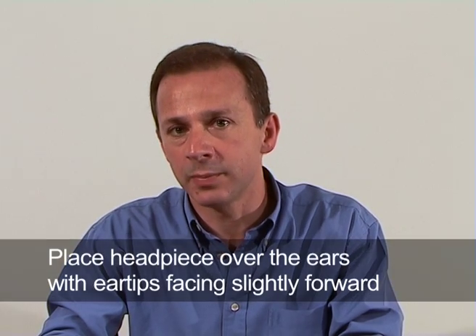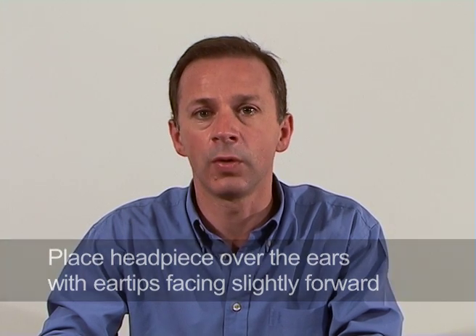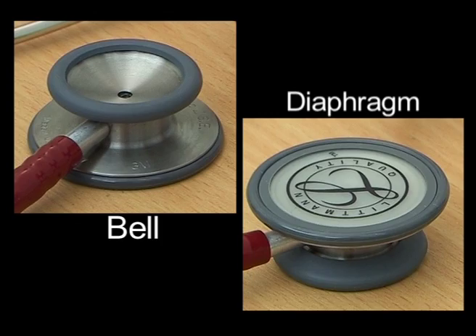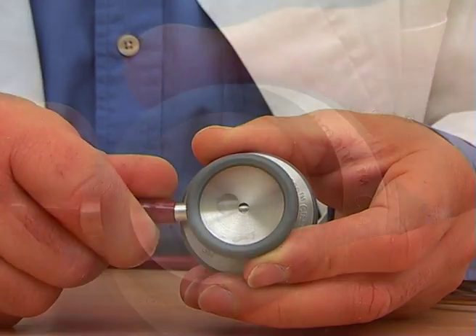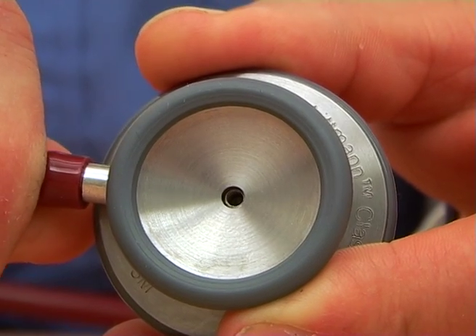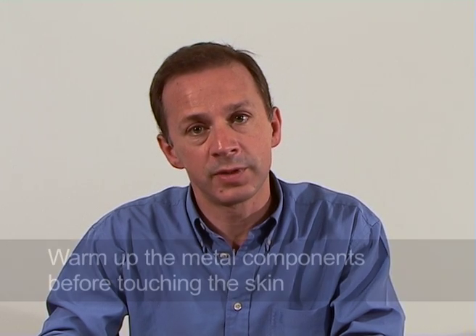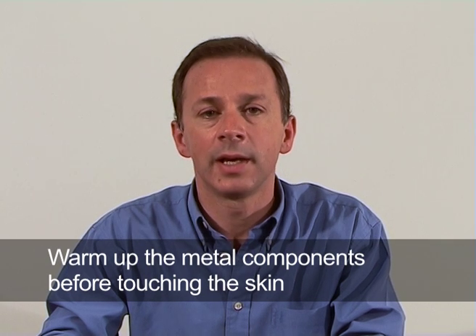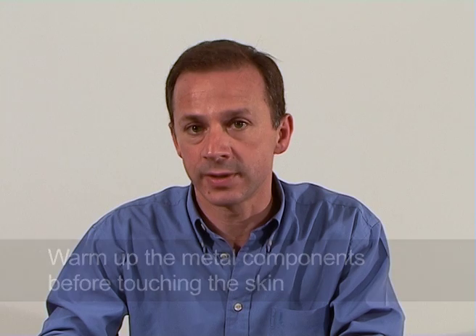Place the headpiece over the ears, ensuring that the ear tips are facing slightly forward. If the chest piece is double-sided, you need to ensure that you have turned the chest piece so that the open hole is connected to the side you will be applying on the patient, i.e. the diaphragm or the bell. Holding the chest piece in your hand for a few moments helps to warm up the metal components before touching the patient's skin.